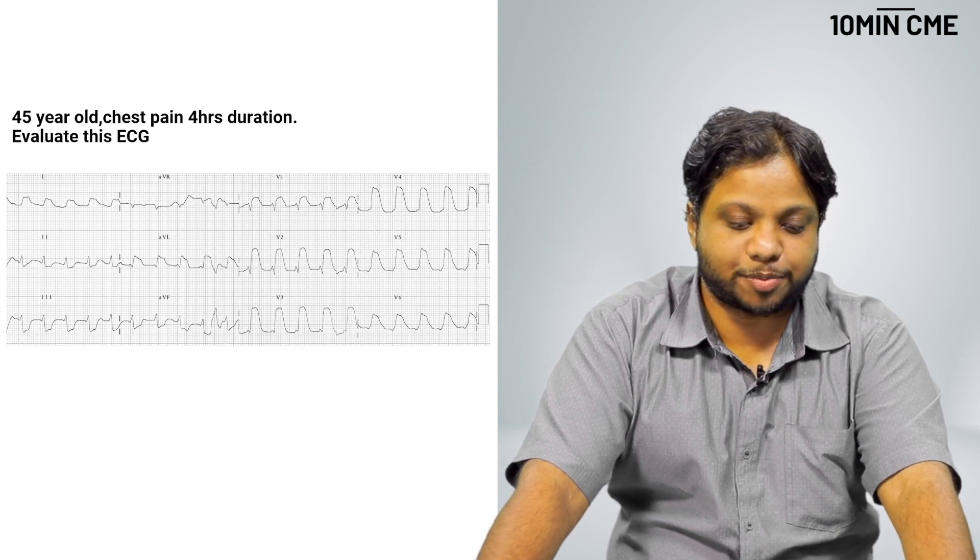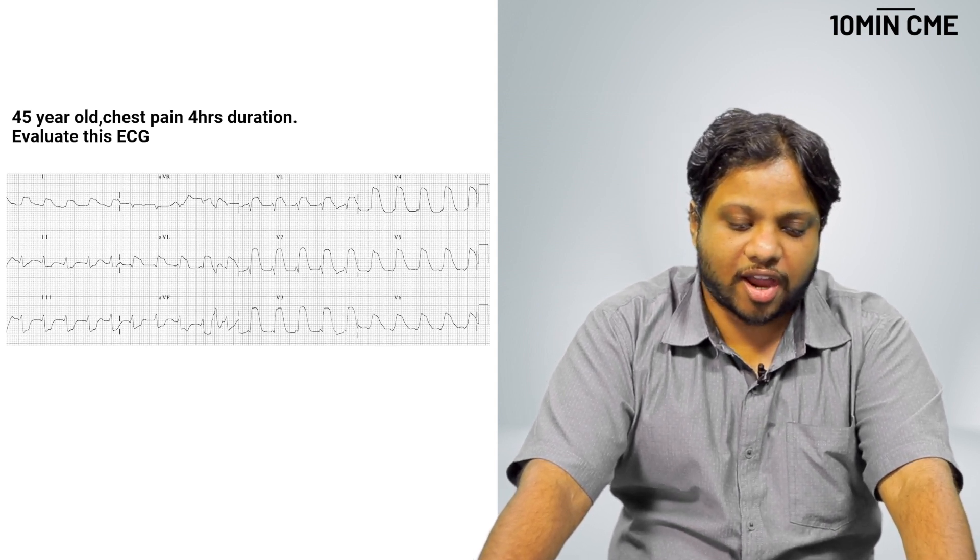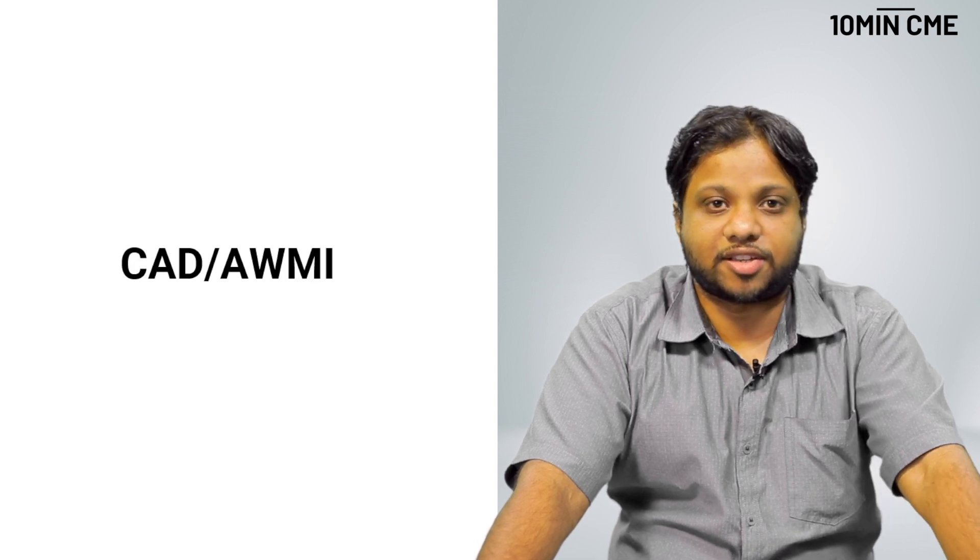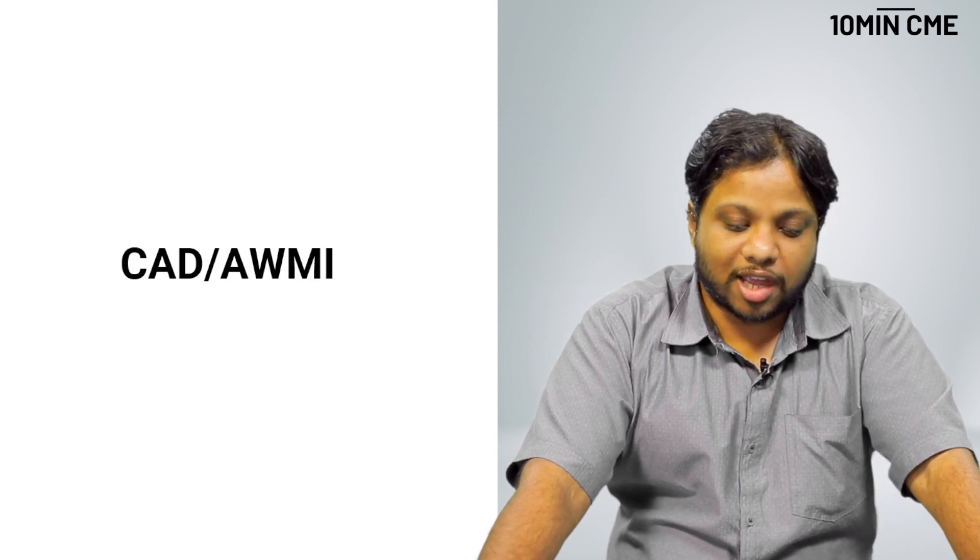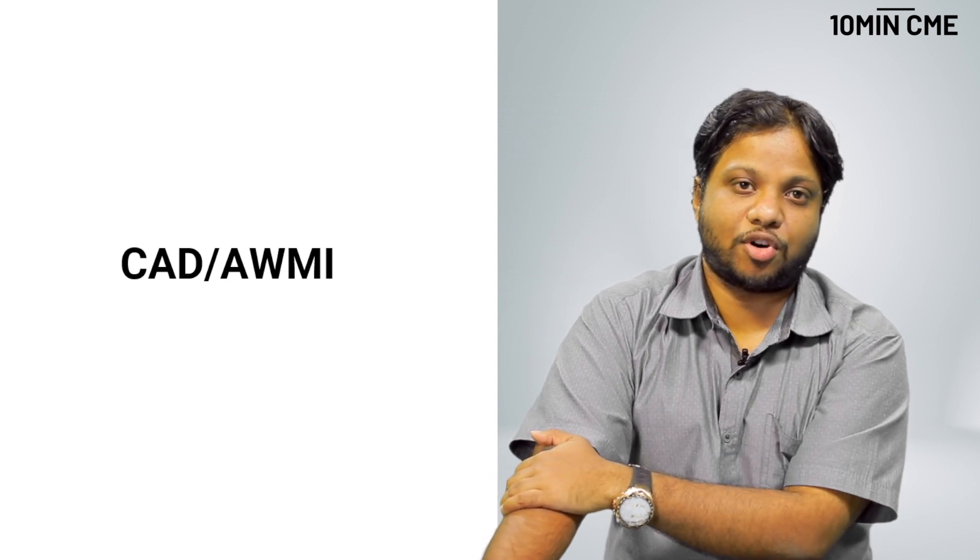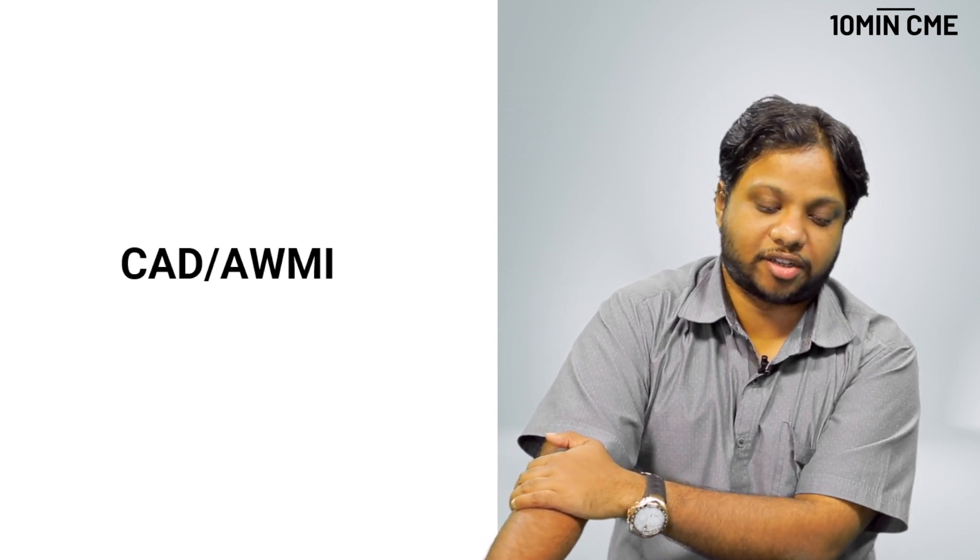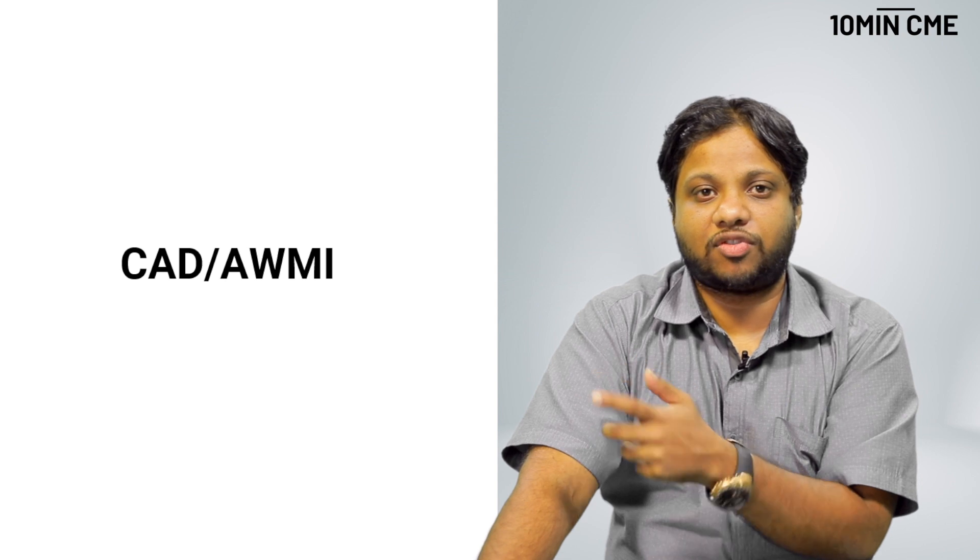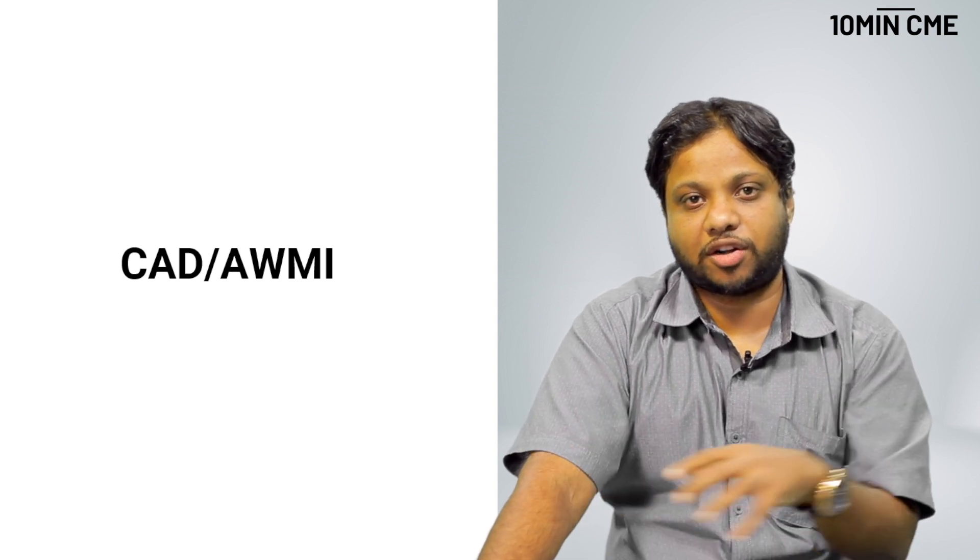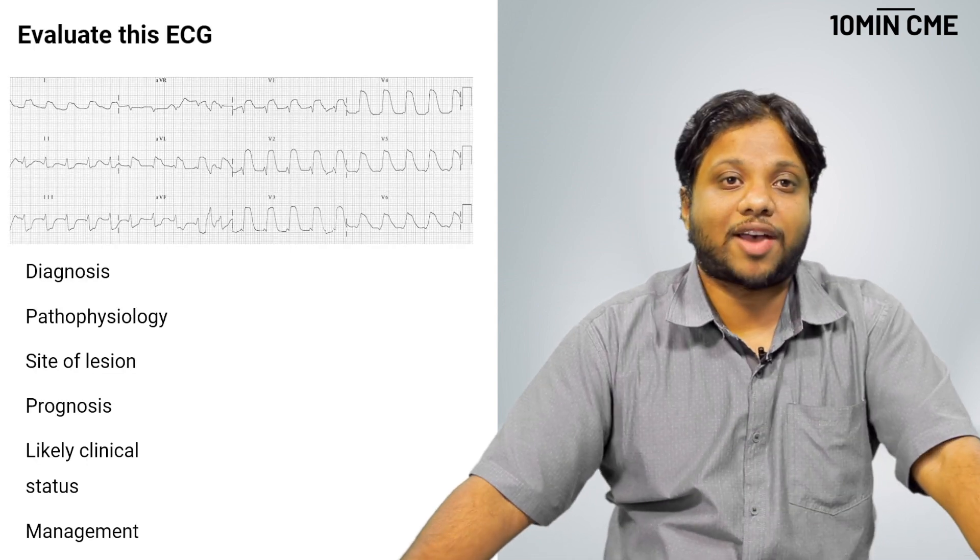Again, a 45-year-old chest pain of four hours duration. The diagnosis is pretty simple. It is a CAD anterolateral MI. I bet most of you people will write this as CAD anterolateral MI and will refer it to a cardiology center. Is there more information that you can get from this ECG? What is this ECG hiding? Let us evaluate this ECG.